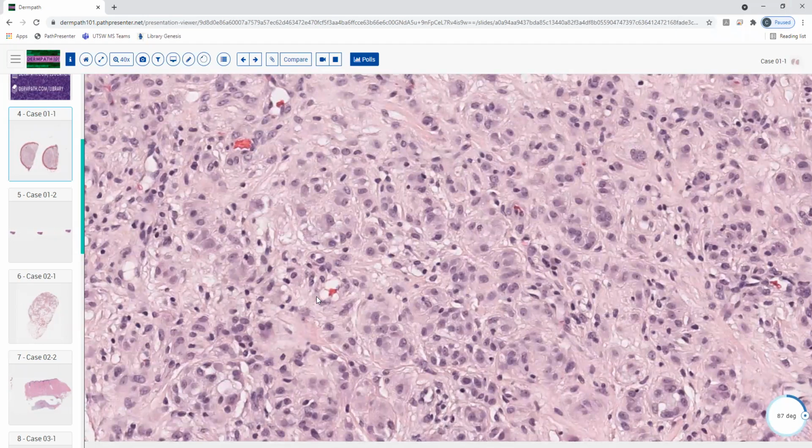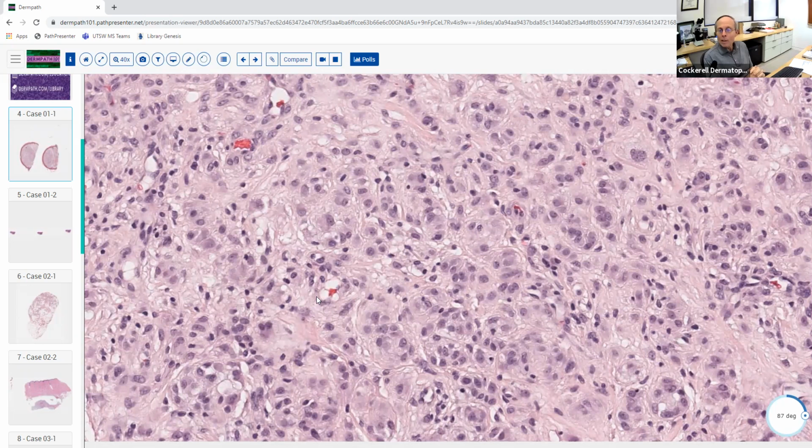Like a histiocytosis? No, we call it granulomatous inflammation. Granuloma, it means that there's granulomatous. When histiocytes predominate, it means that it's inflammation, and we talk about that being granulomatous. Now there's actually more than five, but there's five main patterns of granulomatous inflammation in the skin.